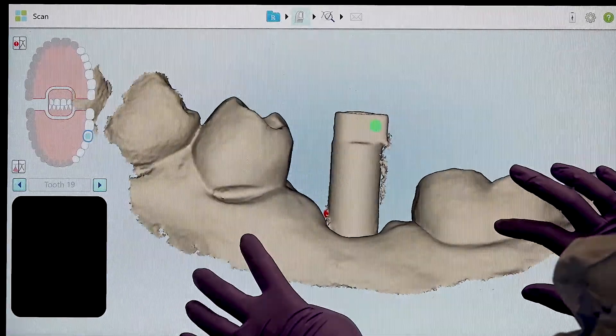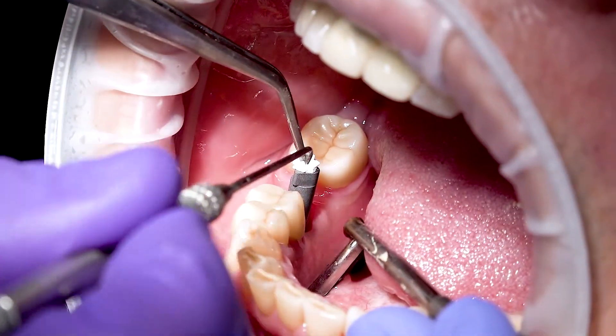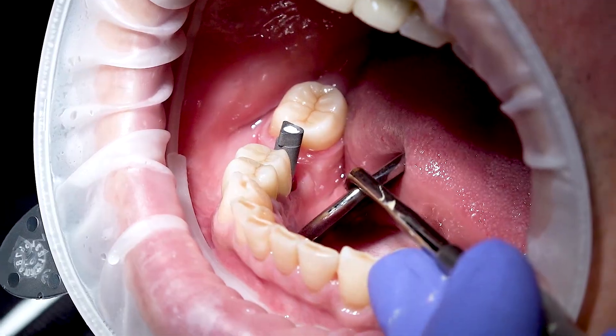If you are having trouble capturing this region, you can easily fill the screw channel with some Teflon tape as shown here. Make sure the tape does not interfere with the geometrical pattern of the scan body.